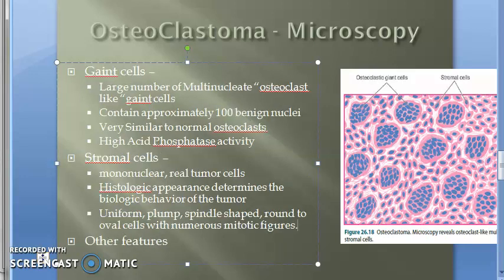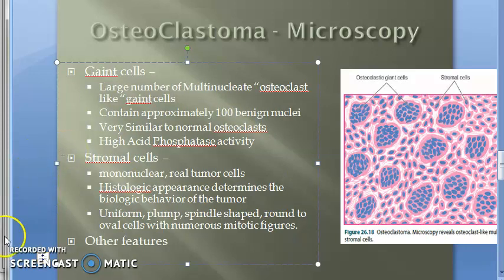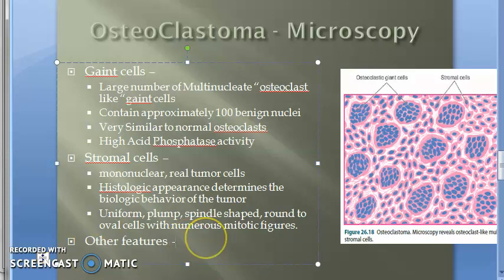Now let's look at the other features of the stroma. The stroma includes scanty collagen, rich vascularity, areas of hemorrhage, and presence of macrophages.